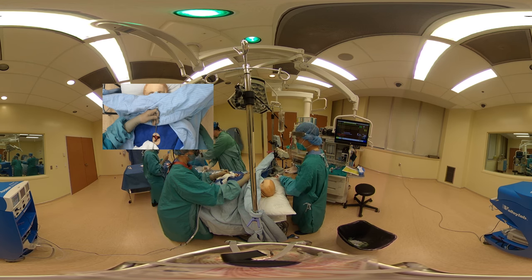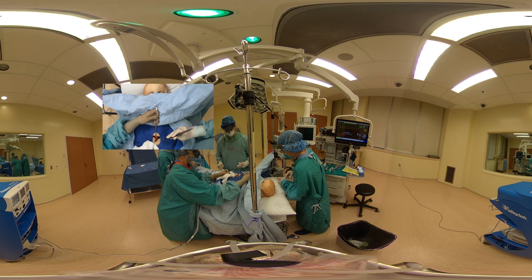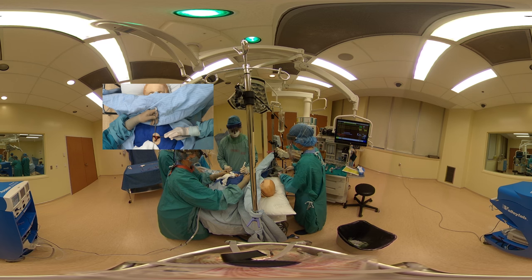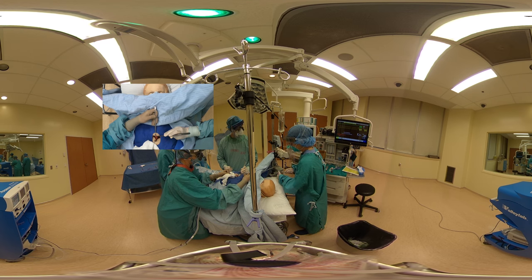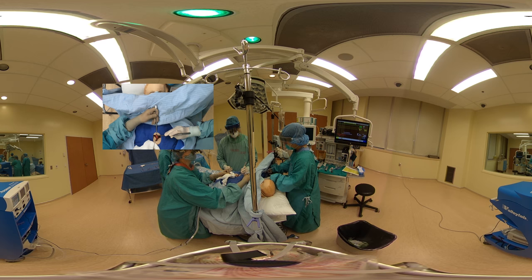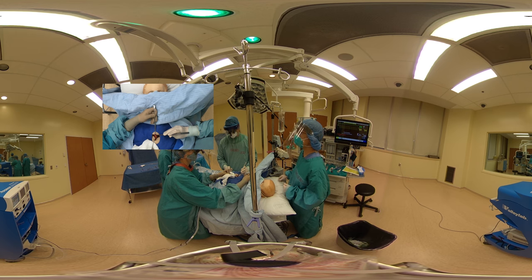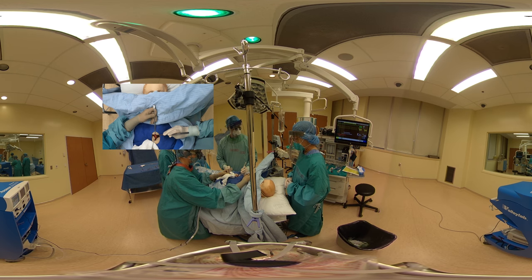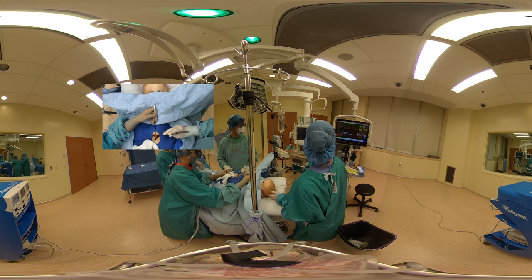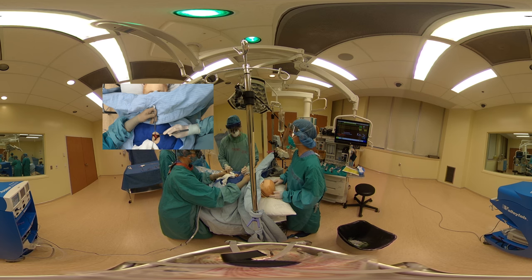I'm going to induce anesthesia now. John, we're going to put you off to sleep now. Take some nice big breaths for me, in and out. You're doing really, really well. So I'm doing a rapid sequence. Propofol is in. 100 milligrams of rocuronium is in. I'm going to turn on my twitcher here. Let me know when he's paralyzed and you can proceed with the tracheotomy window. The twitch shows no twitches — he's fully paralyzed.